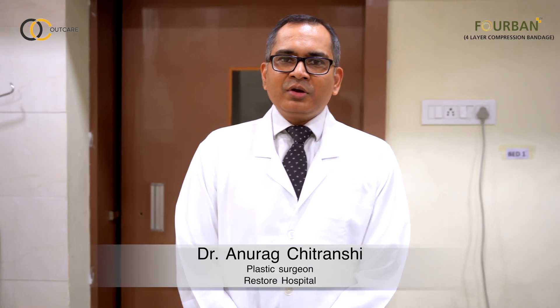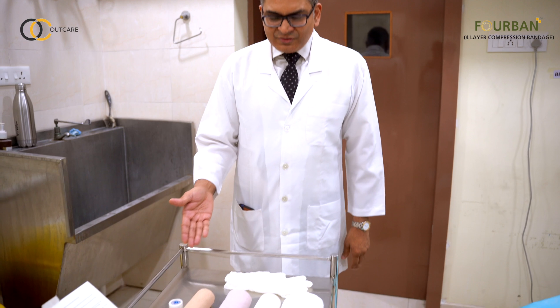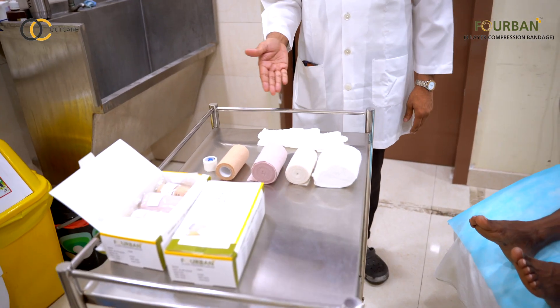Hi friends! Today I will be talking about 4-layer compression bandages. These are the various components you will need to put a 4-layer compression bandage.